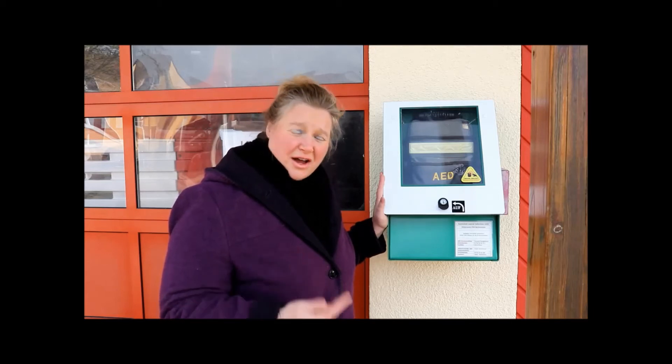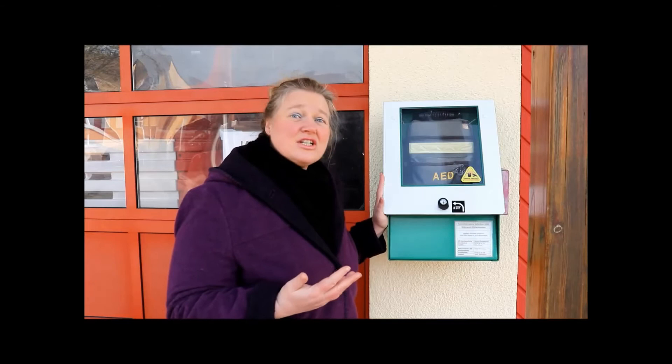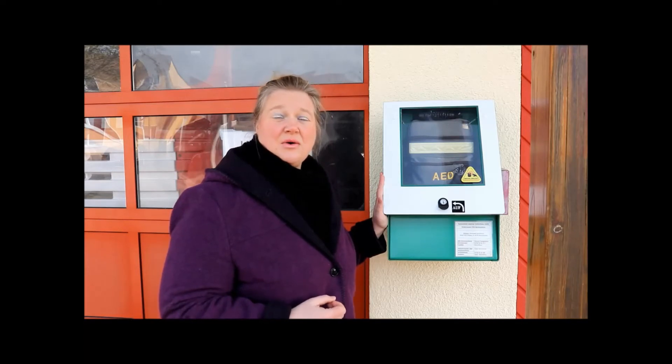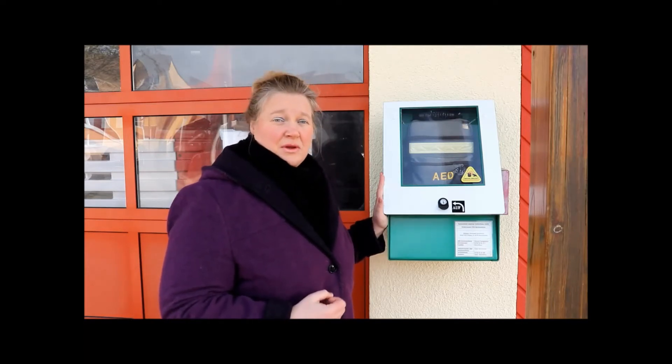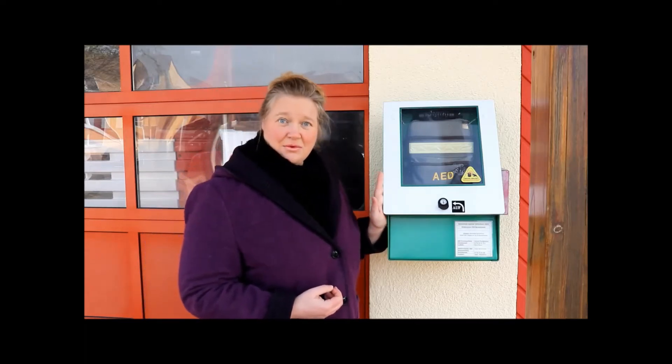Was ist passiert? Gibt es vielleicht sogar Vorerkrankungen, von denen man weiß? Ist es ein Herzinfarkt, ein Hitzschlag oder vielleicht ein Schock, warum jemand bewusstlos geworden ist? Das hilft natürlich ungemein, der Notrufzentrale die richtigen Helfer loszuschicken. Wo ist es genau passiert? Wie viele Personen sind beteiligt? Dann wird normalerweise das Gerät freigegeben und ihr könnt die Tasche entnehmen und zu eurem Patienten eilen.